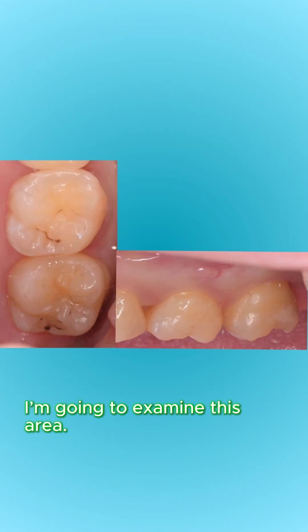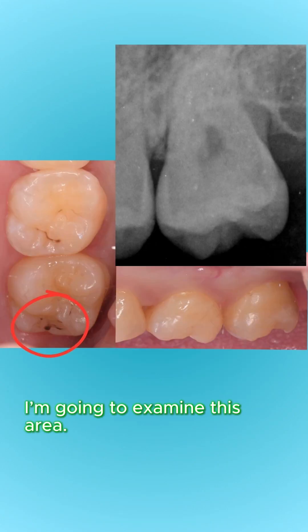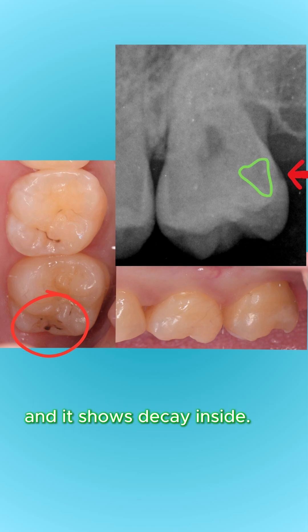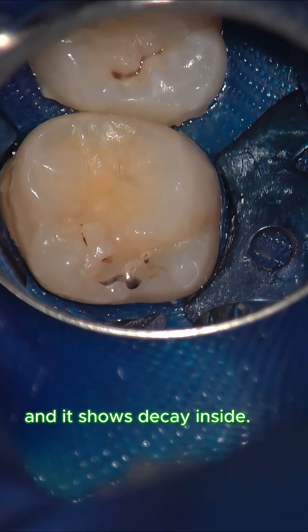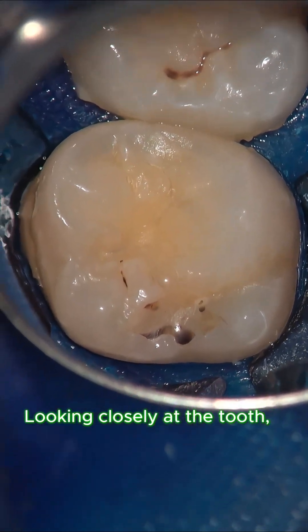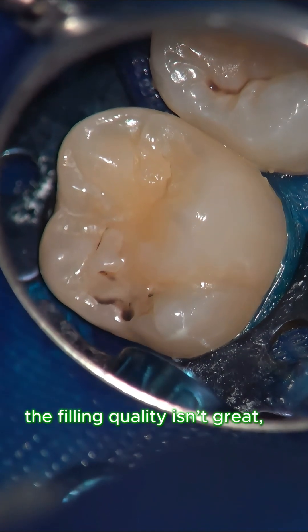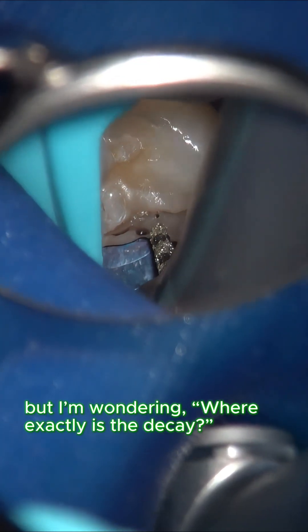Examining this tooth on the x-ray, there is a visible hole showing decay. Looking closely at the tooth, the filling quality isn't great, but I'm trying to determine exactly where the decay is.